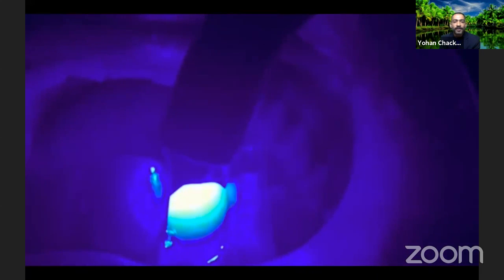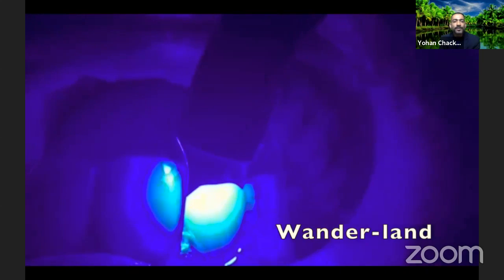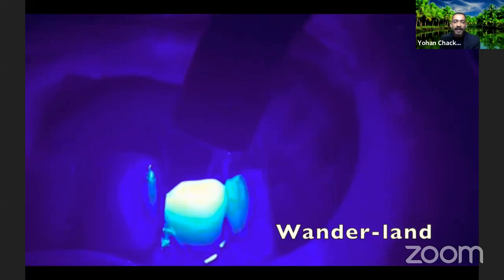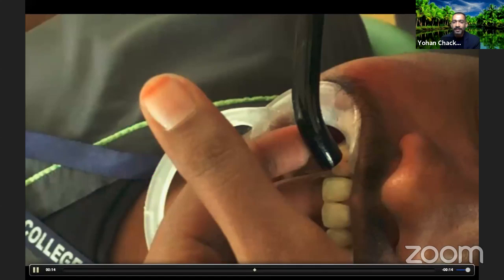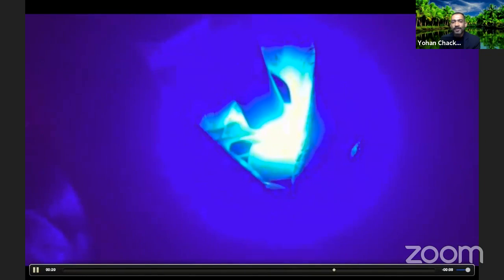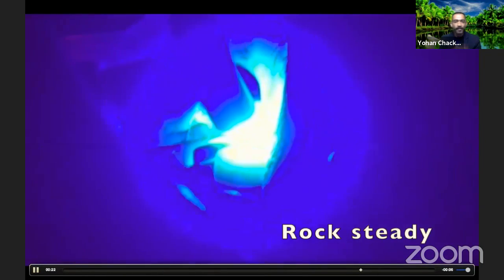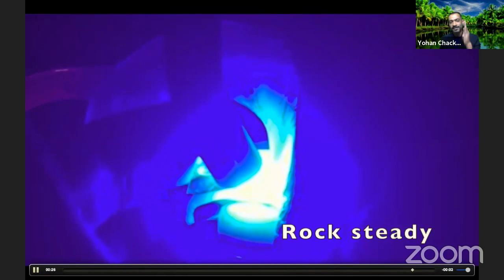So this is what I called Alice in Wonderland. This is what we do if you're doing single-handed composite curing. You can see how that light head is moving. Now here you will see how the finger stabilizes the light head. And now look at what happens. My camera is moving, yes, but the light head is remaining rock steady.